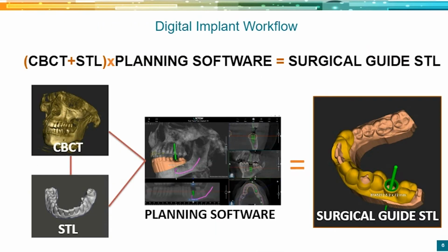Okay, so what do you need to do for the digital implant workflow? What do you need in your office if you want to do this yourself? Okay, so everyone needs a CBCT.